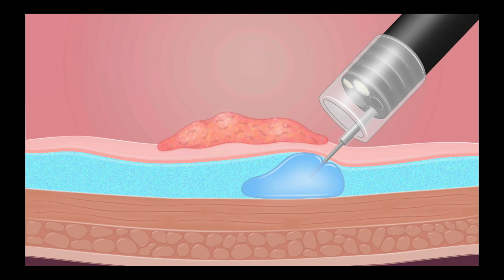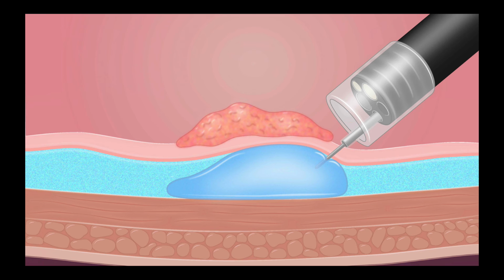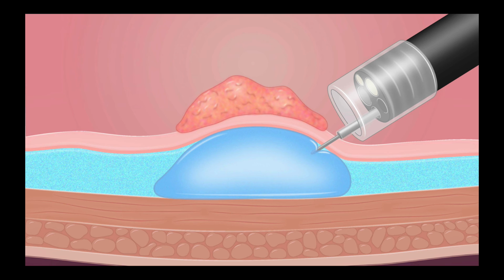Continue to ask your assistant to tap small aliquots till you're sure that it is only in the submucosa, and as this happens, you gently pull the needle back and scope tip up, and you can ask your assistant to inject more to create a nice dynamic submucosal injection. This is how one does a submucosal injection.